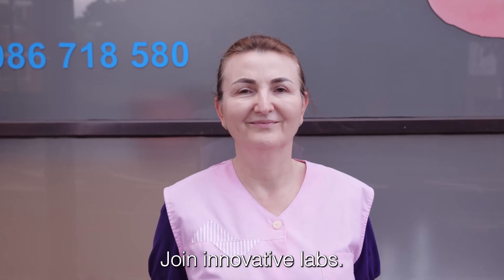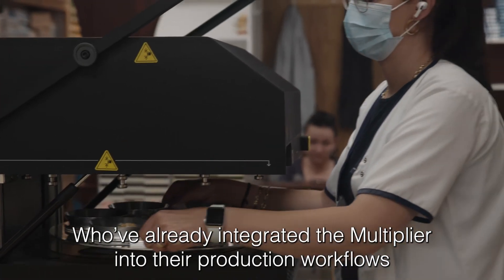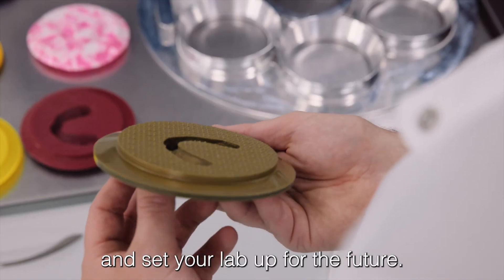Join innovative labs who have already integrated the multiplier into their production workflows and set your lab up for the future.